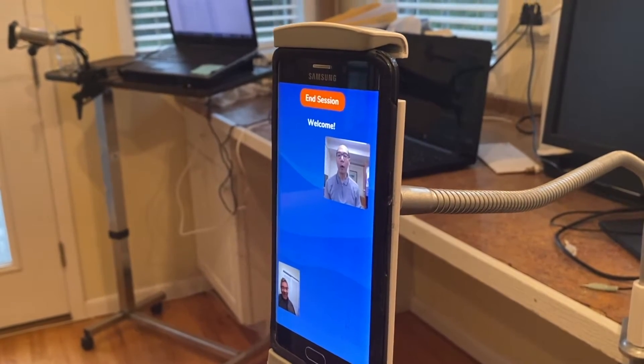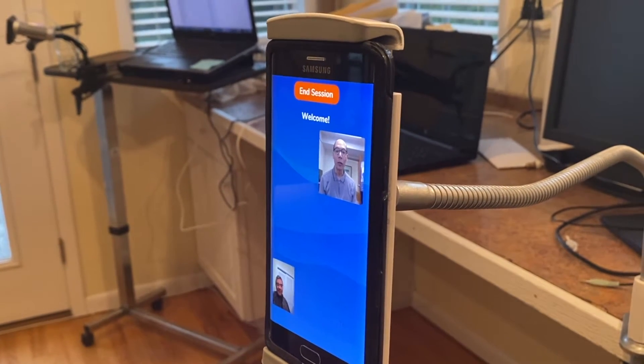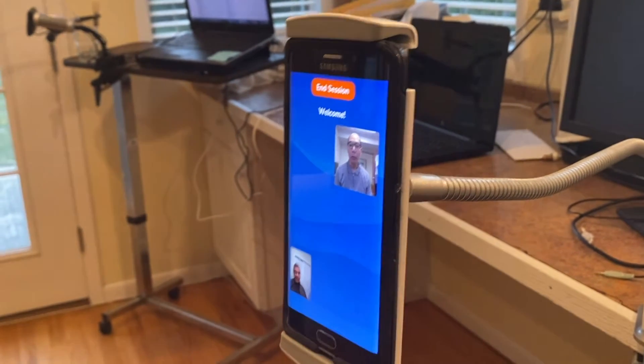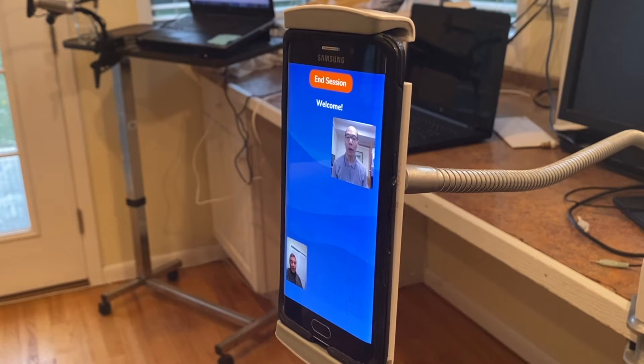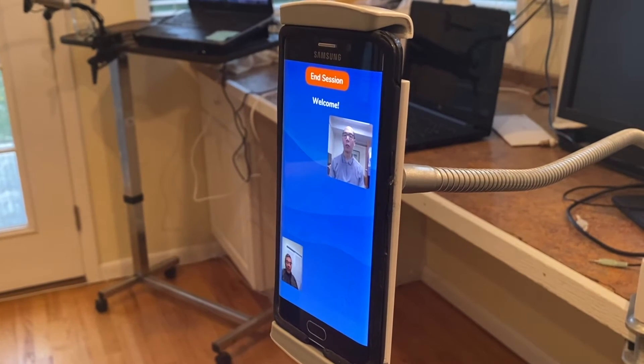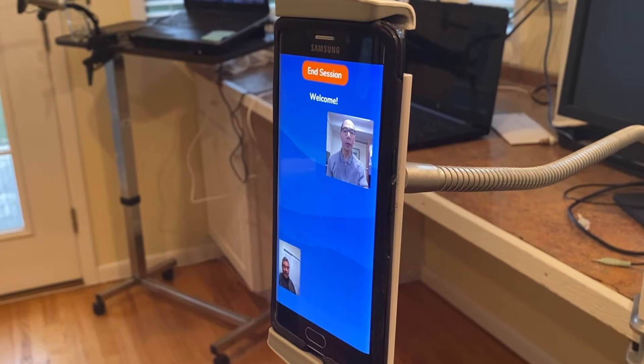We're going to do a Pulmonary Function Test. In this test, you're going to do two or three really big exhales. Each exhale will be followed by an inhale. We'll do the first test, and I'm going to start the series.